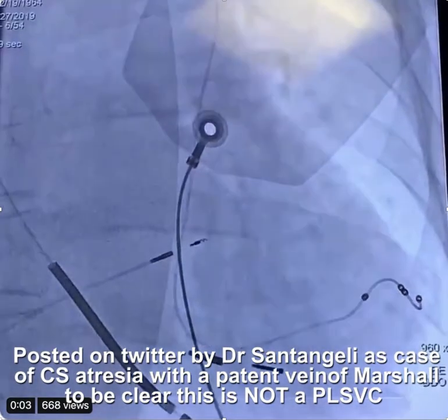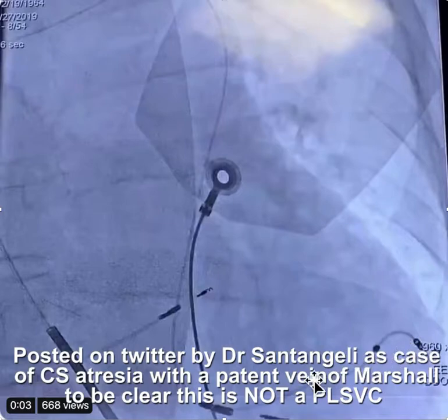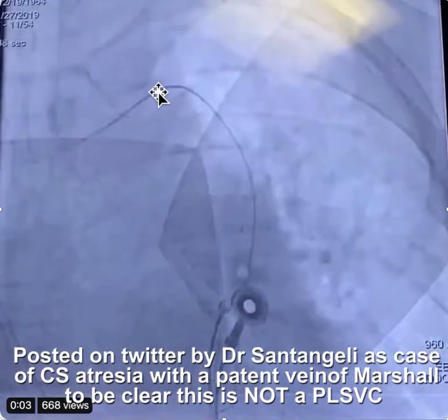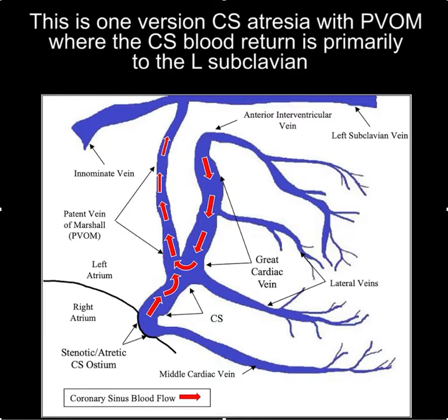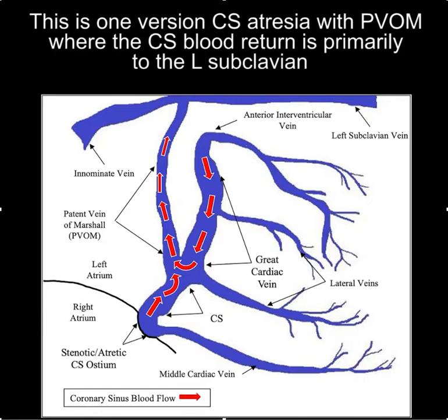So what's going on here? We can see the lead in the coronary sinus — it goes up a patent vein of Marshall and then across to the can, which is on the right side. The anatomy in this case is that there's CS atresia, and the blood flow goes — instead of out into the right atrium — up the patent vein of Marshall and into the left subclavian.